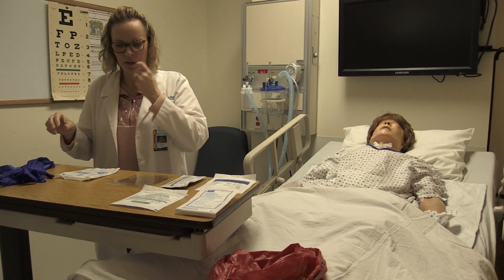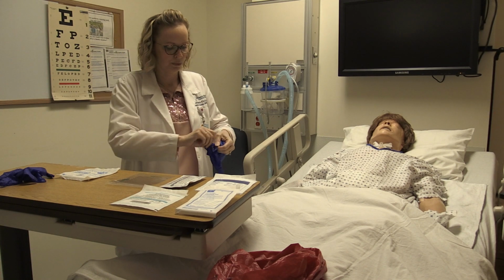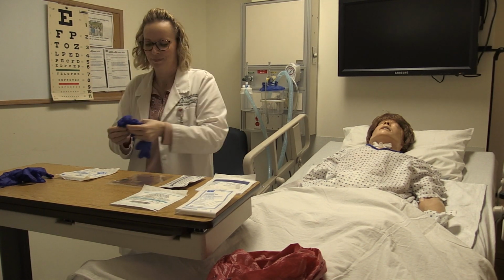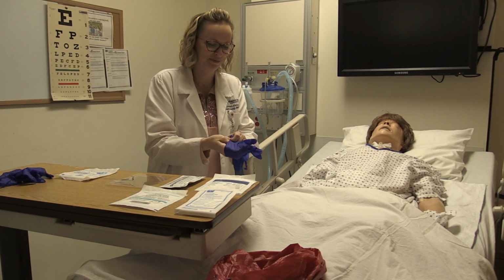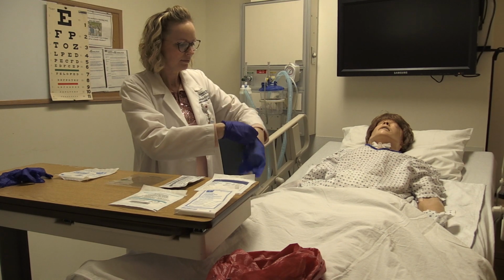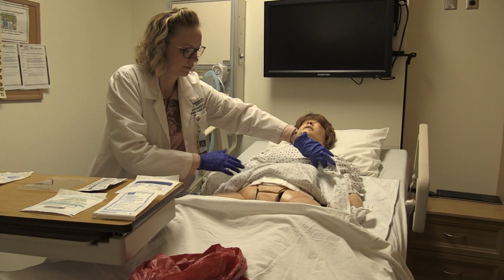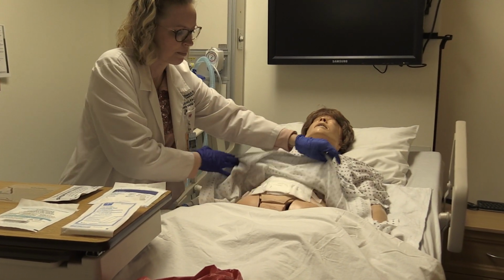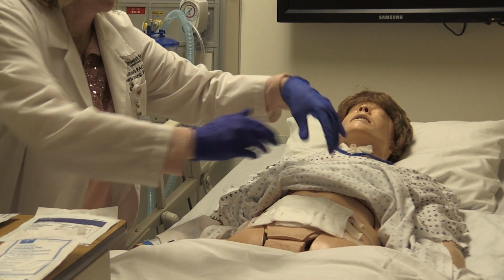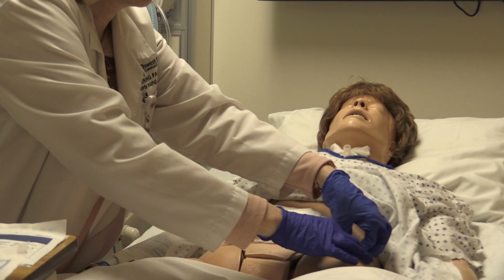So the first thing I want to do is take off the old dressing. So I'm going to put on clean gloves. Let me wash my hands. And then I'm going to put on clean gloves. Cover up the patient as much as you can, but still allow for room for you to work. All right, you're going to remove the tape using counter traction.